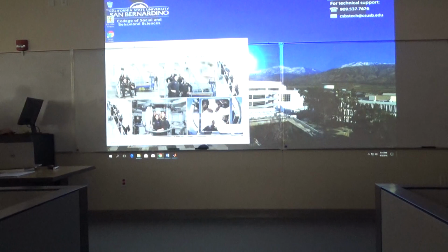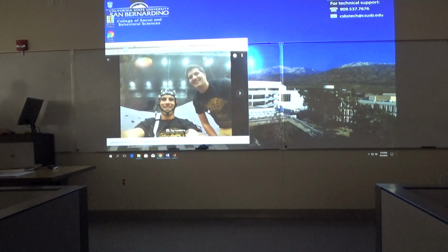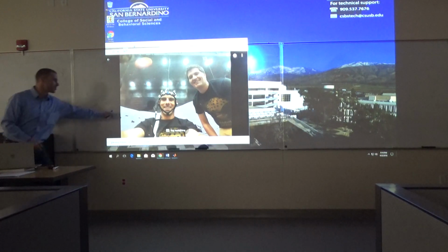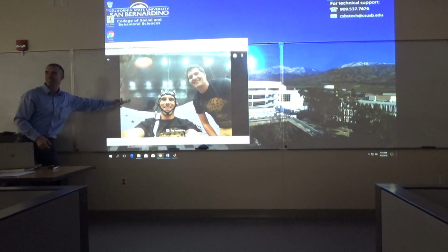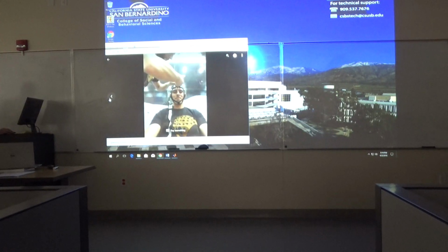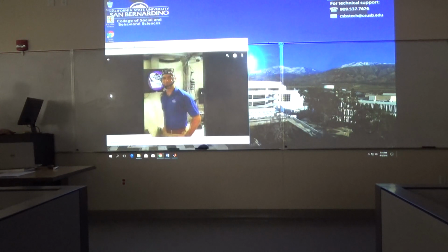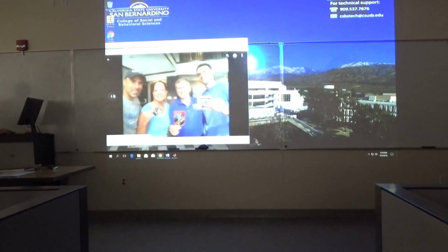But let me see, there are some really good videos. Oh, here's some other EEG. This is getting ready to go. It's kind of like the lunar surface. They just paint the walls, you know. So we were practicing here, and you could do EEG during physical activity, exercise. It's one of the advantages of EEG over fMRI. So we did that, and there's some more EEG.